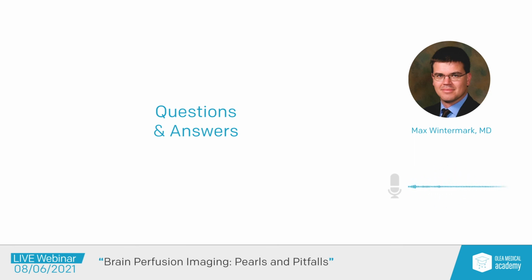And the last thing I wanted to say was that, of course, there's also a CTA, the patient may get an angio, the patient may come back for follow-ups. It's particularly true for patients suspected of vasospasm. And that should also be the reflex of the radiologist. When you get your third request of CT perfusion, CTA in a patient, perhaps it's time to call the clinician and say, do you really need it? Do we really need to do all that again? Patient had it already twice.